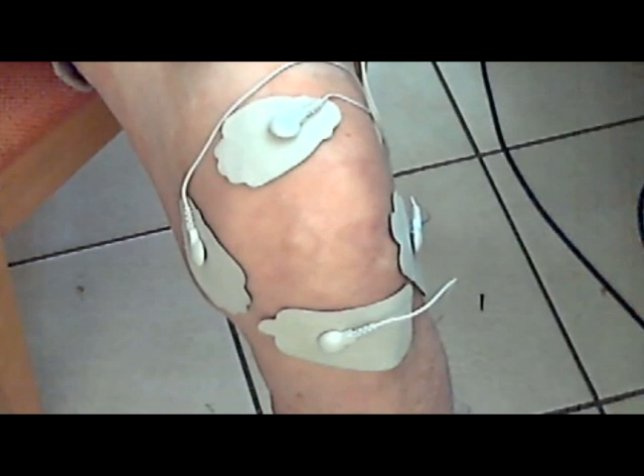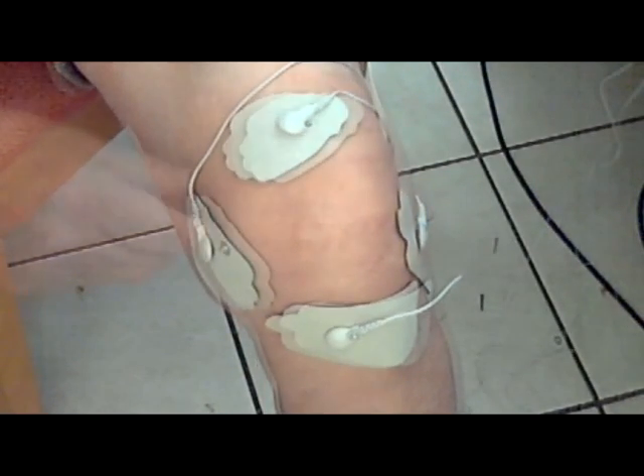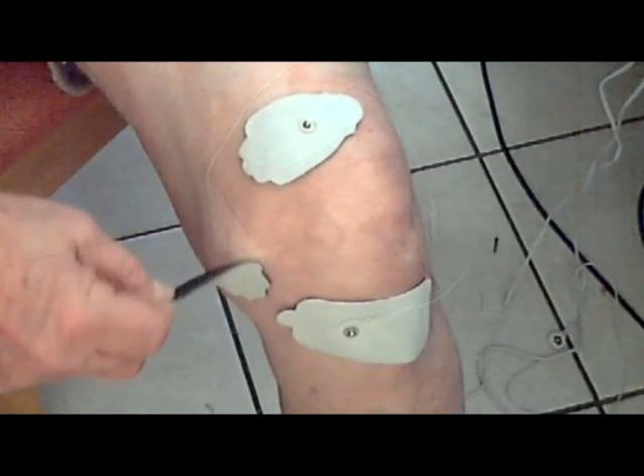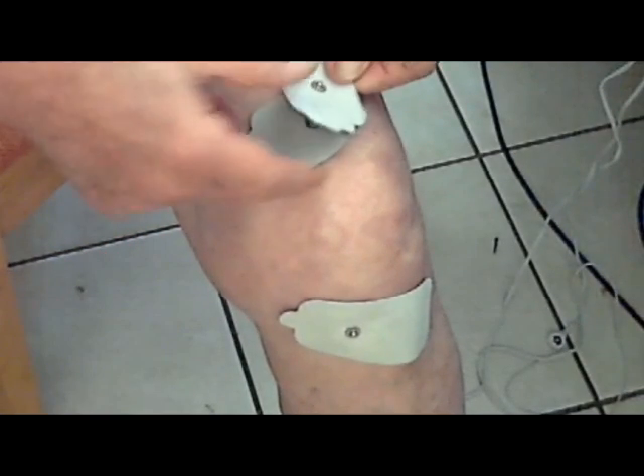When your treatment is completed, replace the electrodes on their protective plastic backing. This will keep them nice and fresh for the next time you use them.